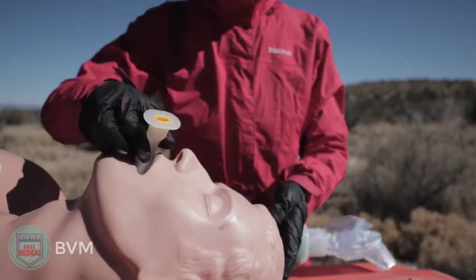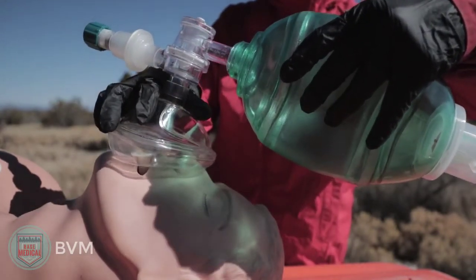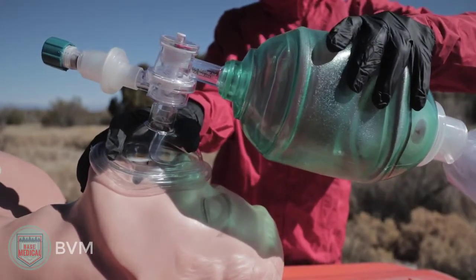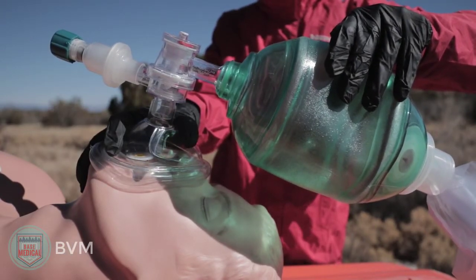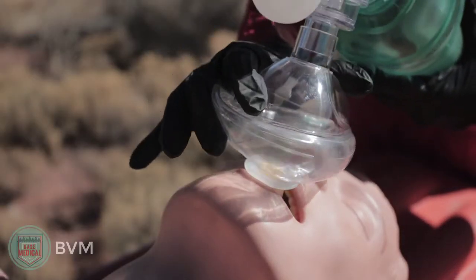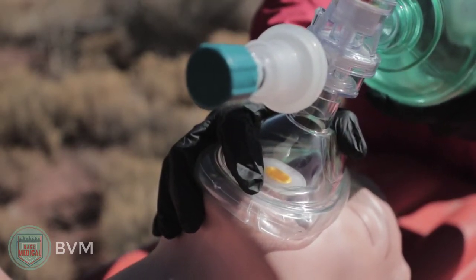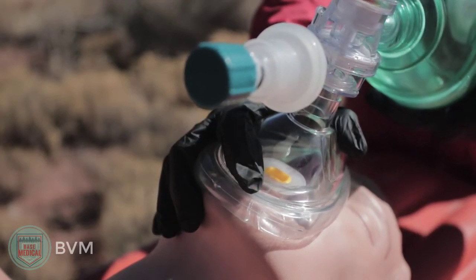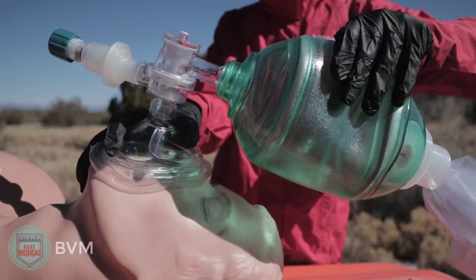The mask seal is another important consideration. Place the mask so that the narrow part is over the bridge of the nose, with the wider end resting on the chin — the mask should create a complete seal around the mouth and nose. Apply slight pressure to maintain this seal with the EC clamp technique. Create a C with your index finger and thumb over the upper part of the mask. The other three fingers, or the E, are used to grip the jawbone and maintain an open airway. Do not grip into the fleshy part of the neck. No air should escape from the seal when you squeeze the bag.